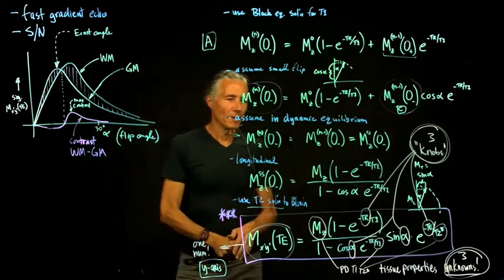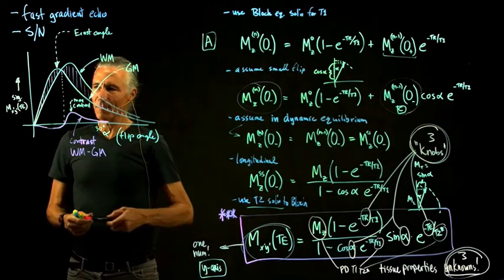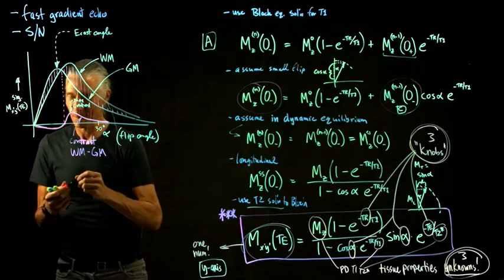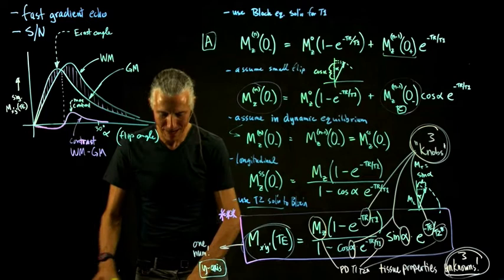So when you go on the scanner, you'll have some flip angle like 7 degrees or something, and that one really works out well, and you're all happy. But you ever wonder, what if I put in 6 over there? What about 9? What would happen?